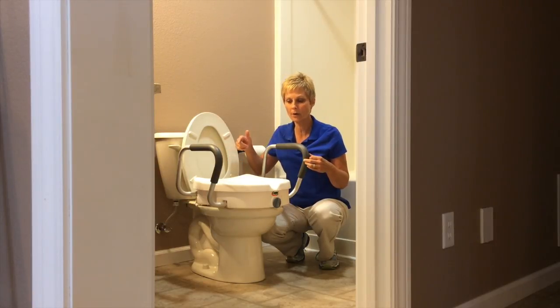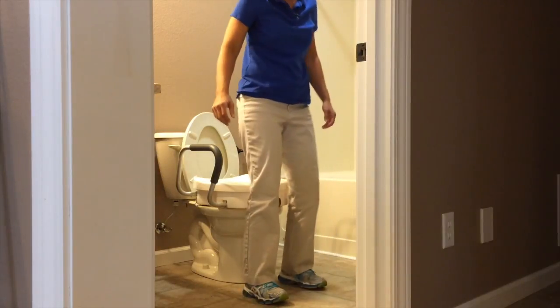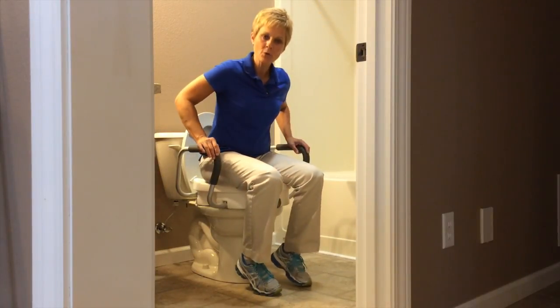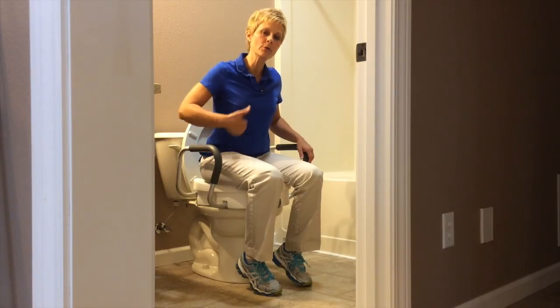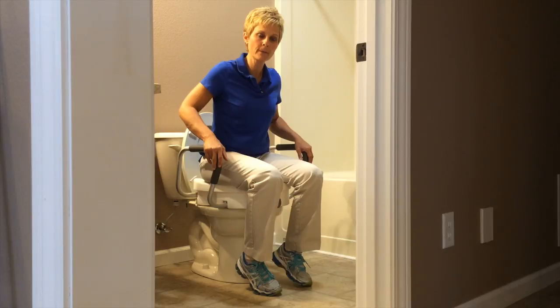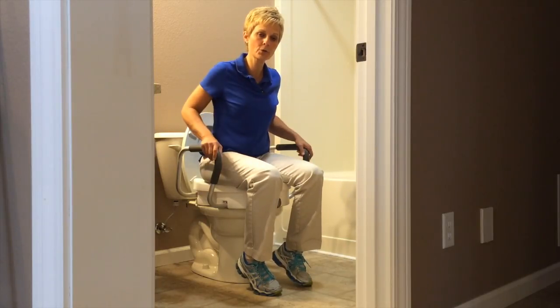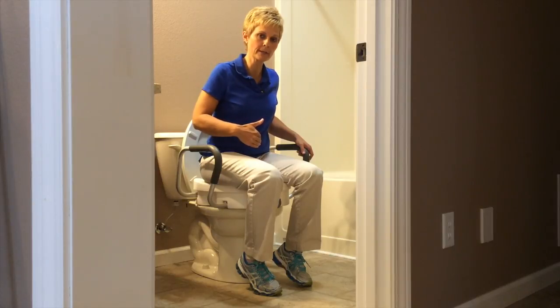Now I'm going to show you how to get on and off of this. When you go to sit down and when you go to get up, try to put even pressure on both handles here. You're going to get your body weight forward — get your nose over your toes to push yourself up off the toilet seat.